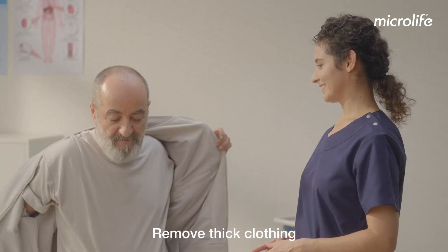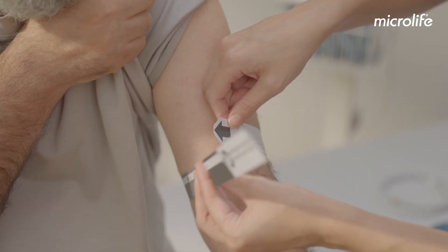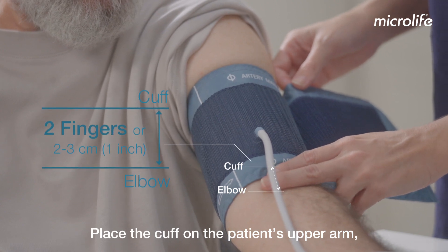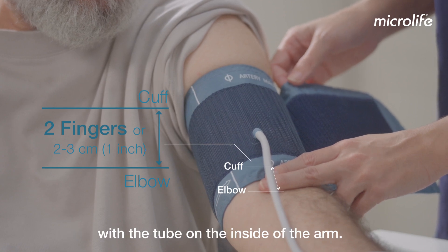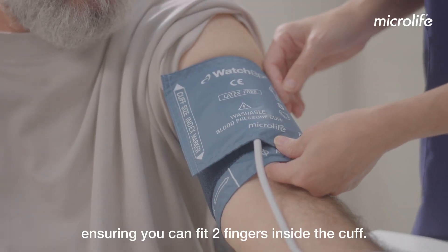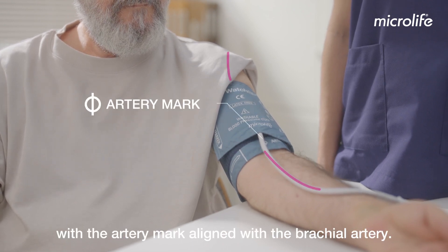Remove thick clothing and measure the arm to ensure the correct cuff size is used. Place the cuff on the patient's upper arm above the elbow, about two fingers or two to three centimeters, with the tube on the inside of the arm. Fit the cuff properly, ensuring you can fit two fingers inside the cuff. The cuff should be at heart level with the artery mark aligned with the brachial artery.